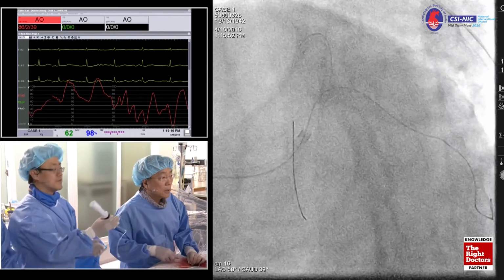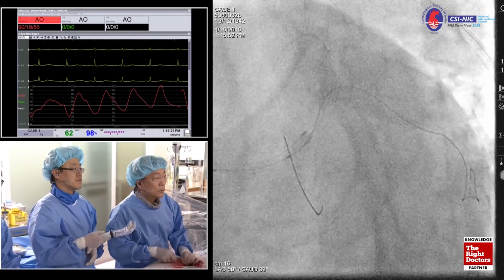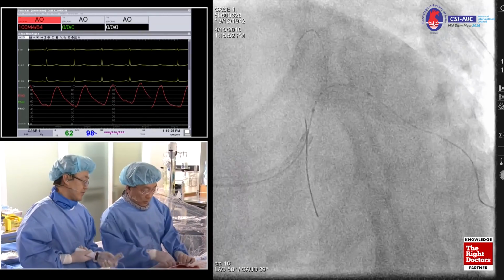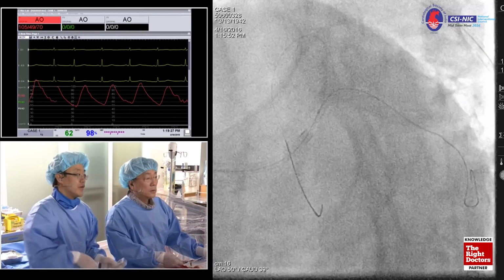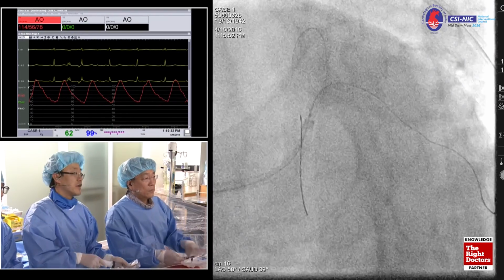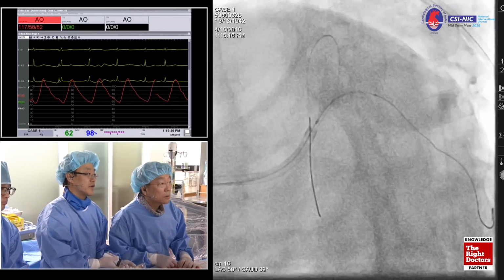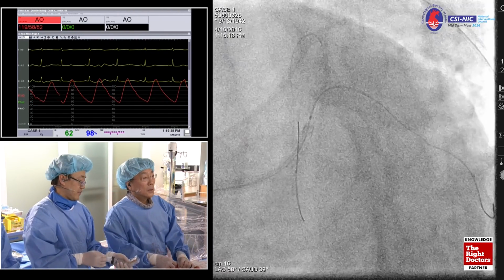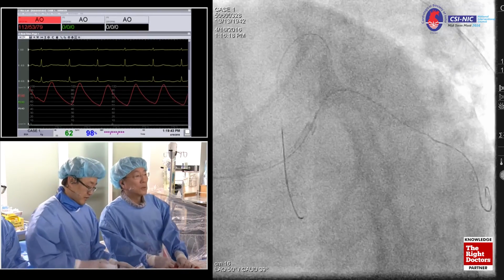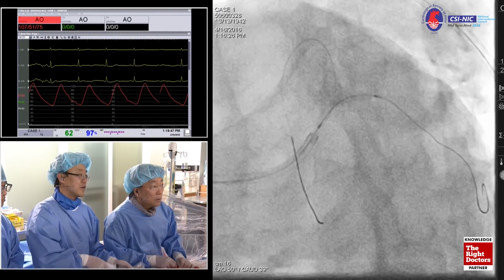We have already dilated with the 2.5 balloon. So this is a 2.5 balloon. Okay, why not? Inflate to 8, 10. Just a minute. Okay, you want to see that? 10. One more. It's quite easy. One more. 12, 13, 14. Okay, no problem.